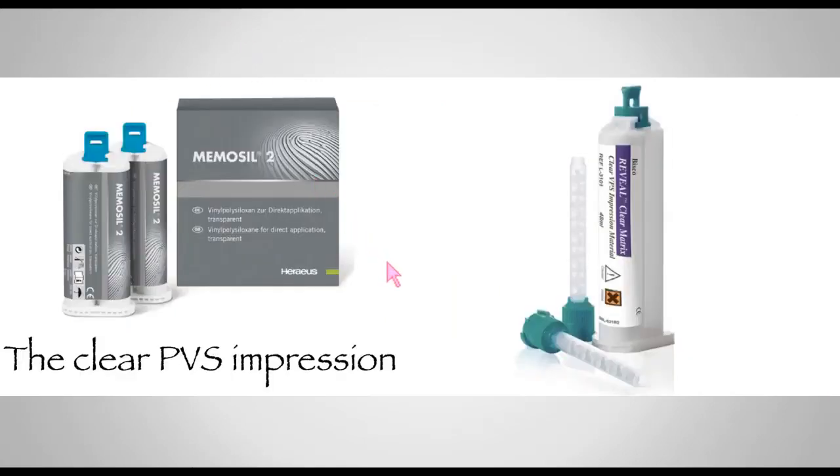The other thing is that once the clear triad is fabricated, you're not going to use the putty matrix at all. So you can just disregard the putty matrix. All you're going to use from now on is that clear triad tray. And since it was cured on top of the very smooth surface of the putty matrix, there are no retentive features within that clear triad, so you don't need to use any type of adhesive.